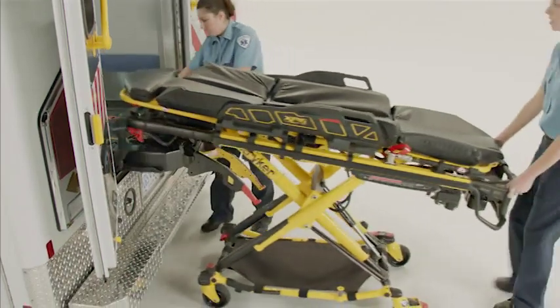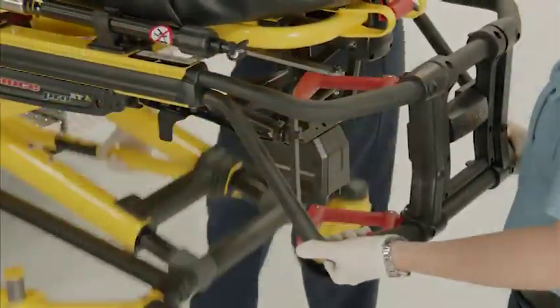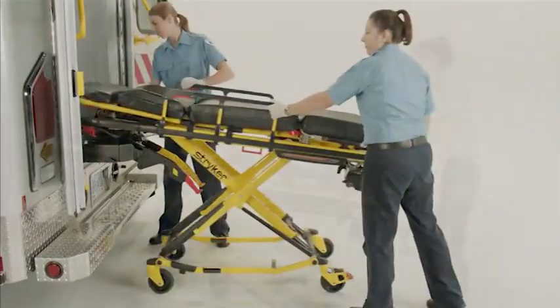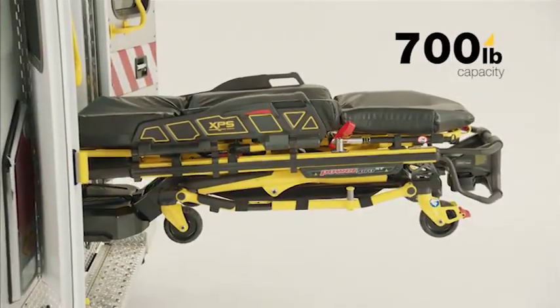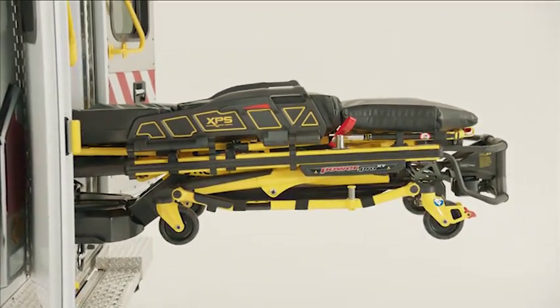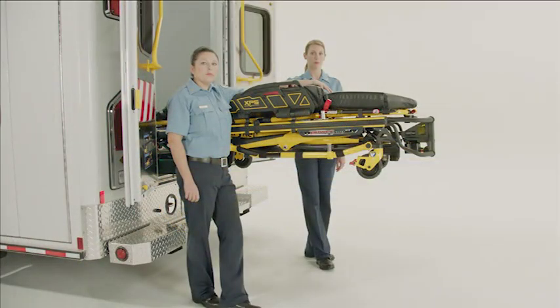The following segments will guide you through the operation of the Power Load system with powered and manual compatible cots. You should practice using the Power Load system with an unoccupied cot before attempting to operate the system with the patient. The Power Load cot fastener system can support a patient up to 700 pounds plus the weight of the cot. Stryker recommends two trained operators with an occupied cot at all times.